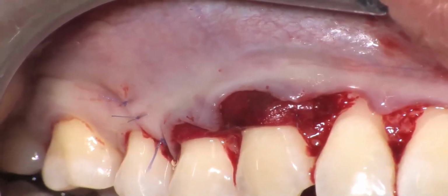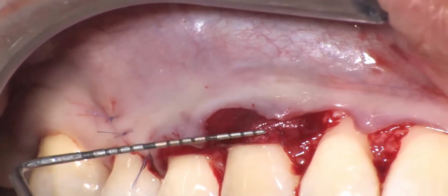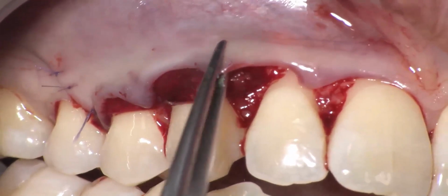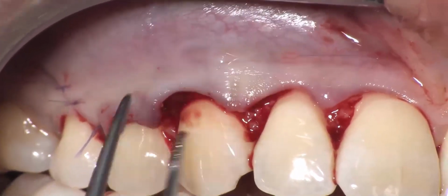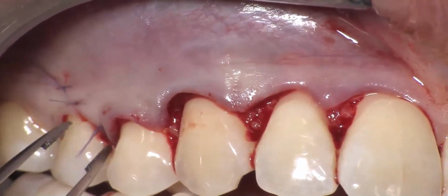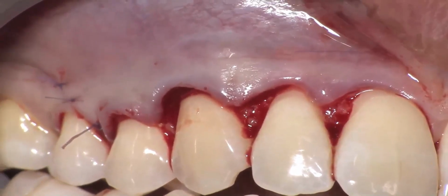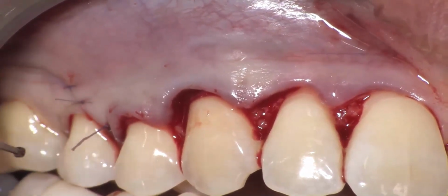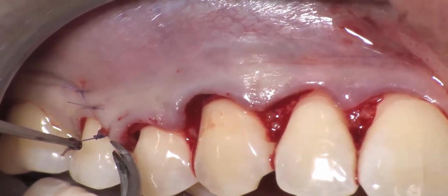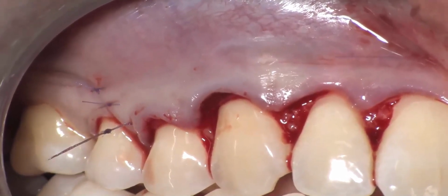Now I'm going to give the suturing mesial. Look at how nice is the coagulum here, how thick it is. We have to cover it completely with our flap and put it below. This suture, which was done before, now is going to be removed because it was done when there was too much tension, as I told you yesterday. And I will give it again now that there is already the vertical releasing incision open.